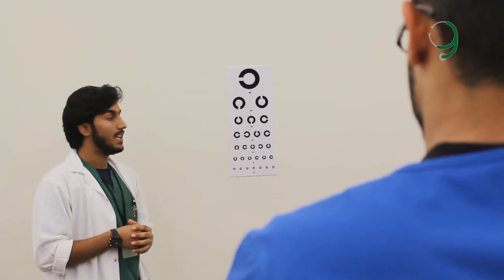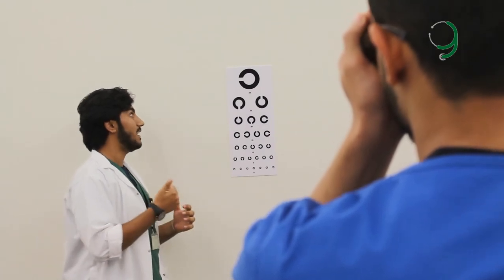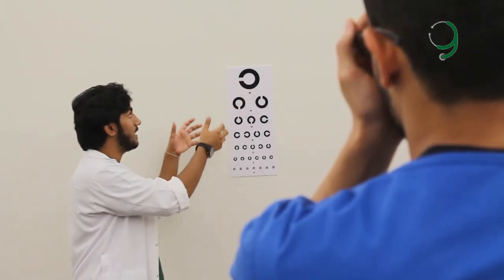Next, you have to alternate the eyes. Tell him to close the other eye and ask him the same thing. And if he couldn't see the first letter, then you have to bring the Snellen chart closer to him until he can see it. If he still can't see the first letter, ask him to count your fingers in front of his eyes. Can you count this? Four. And if he can't, use hand movement. Can you see this? And if he can't, use light perception to see if he can see light.